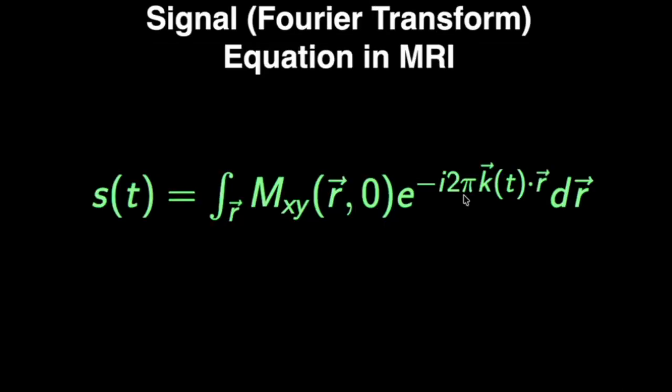And if you add enough of them up, you can break any image down into these components, and correspondingly, if you encode that spatial information using this process, you should be able to detect it again. And this is the very generalized Fourier signal equation.